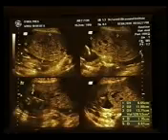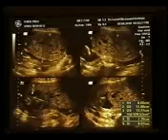This is normal placenta and embryo, and adjacent we can see the abnormal molar tissue with cystic changes. Cystic area, this is typical molar tissue, and this is what is described as snowstorm appearance. Nowadays, with better machines, we can see the cystic areas properly.